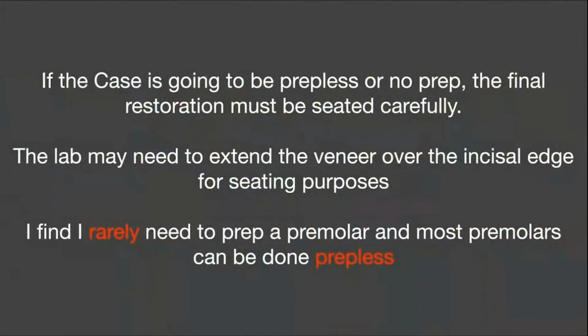The case is going to be seated prepless or no prep. The final restoration must be seated really carefully. The lab may need to extend the veneer over the incisal edge just to be able to seat it. And I find it rarely do I need to prep a premolar. Most premolars can be done prepless.